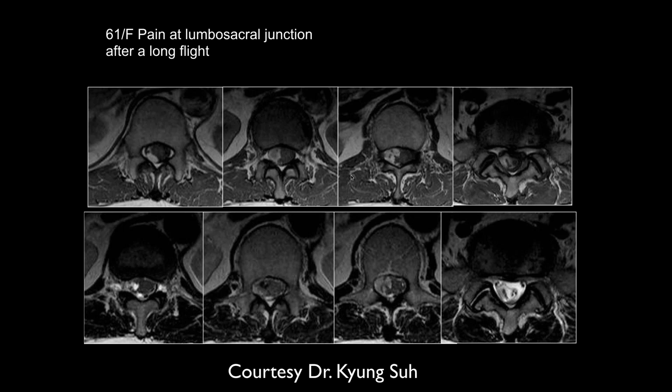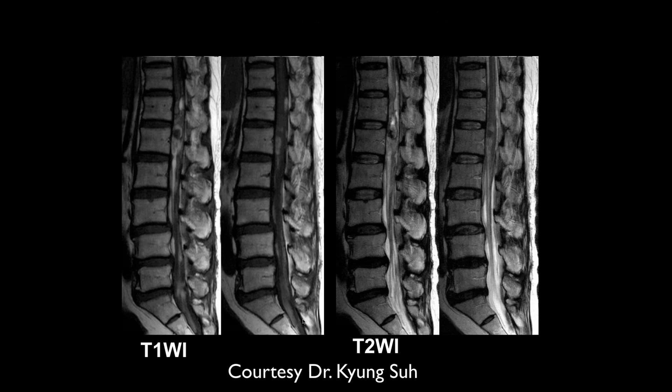Next: pain at the lumbosacral junction after a long flight. We have T1-weighted images and T2 images. There's a space-occupying process in the canal. On the contrast sagittal images, the differential includes drop metastases — though it's really the entire spine involved, suggesting diffuse meningeal metastatic disease. There's a lot of funny signal that could suggest metastatic disease; melanoma could look like that.